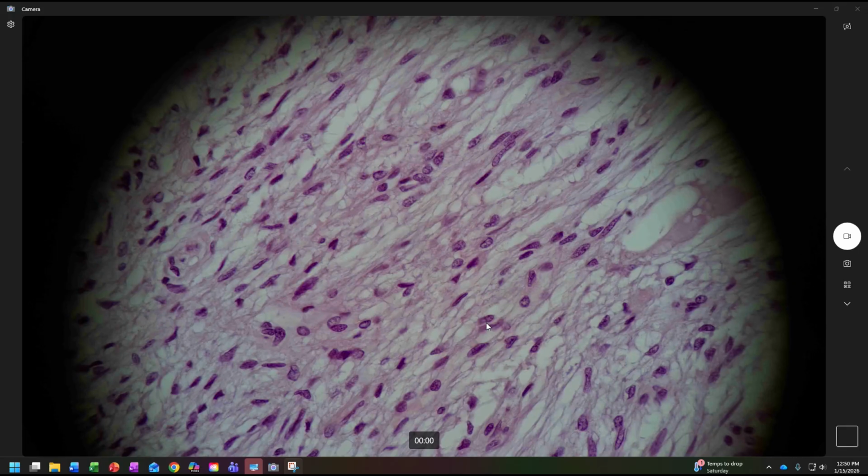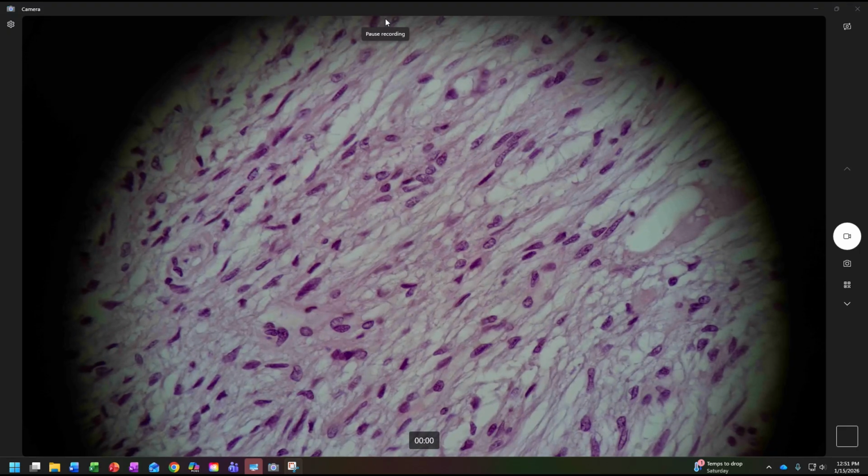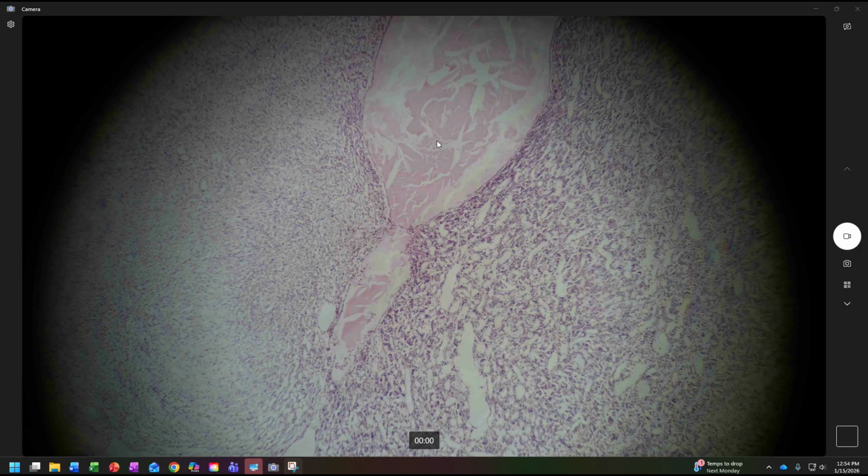Okay, I'm going to switch slides. I want to get another one. We'll see if we can find one that looks different, but still, what are we looking for? We're looking for the things that are consistent. All right, so here is a third sample. Now this is not as distinct as we've seen in the previous two samples, and just so you know, I'm speaking to students in my class. I wouldn't really feel comfortable showing you this and asking you questions, but I'm going to go ahead and show it just because I do want to point out what are the consistent things that we see.